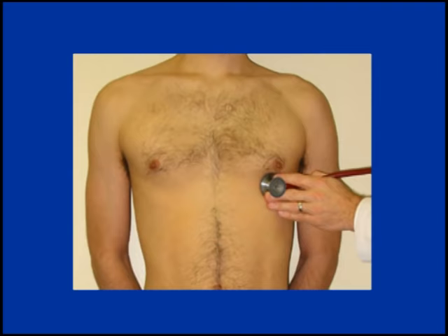Recorded at the apex. Mitral stenosis. Recorded at the apex. Mitral regurgitation.